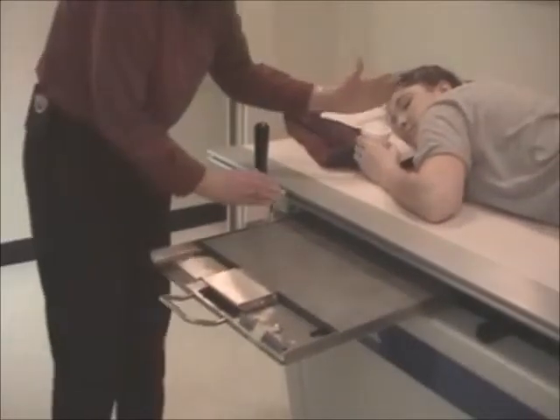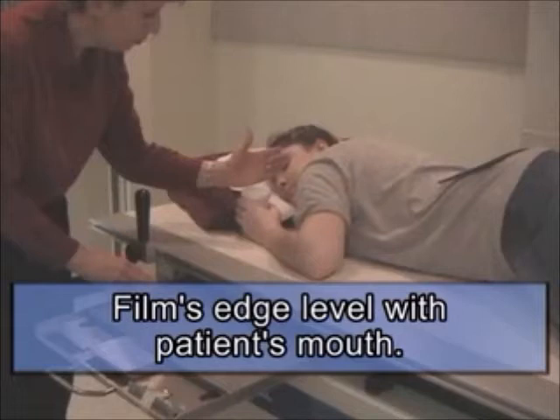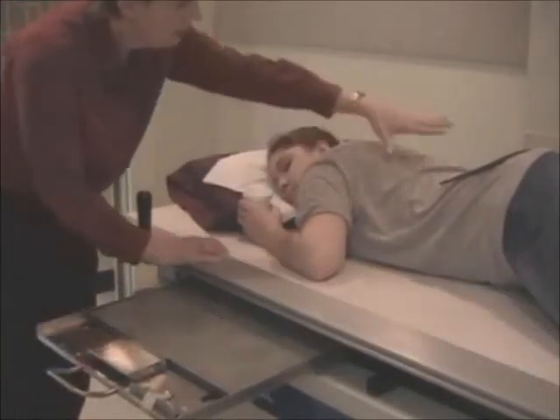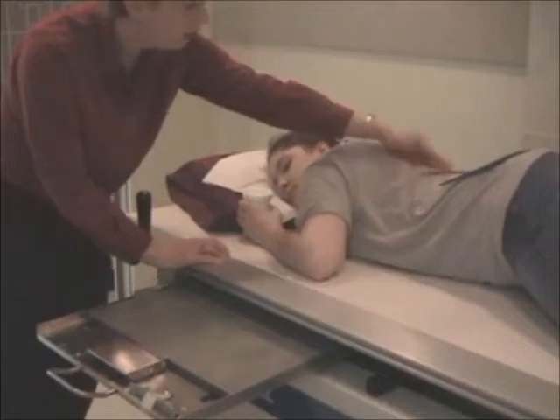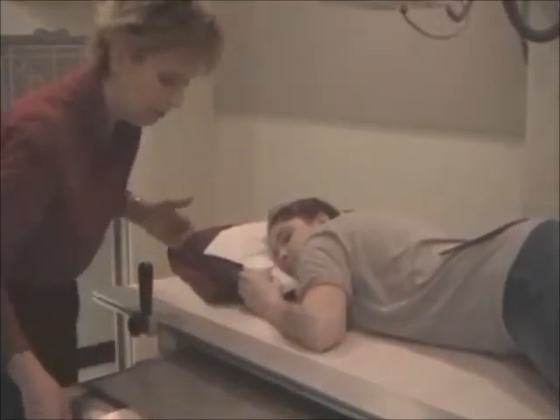The film's edge will be level with your patient's mouth. The top of the film will be level with your patient's mouth. The esophagus, the patient swallows barium, and the stomach is approximately here. So you can see the esophagus will be the focus of this film here.